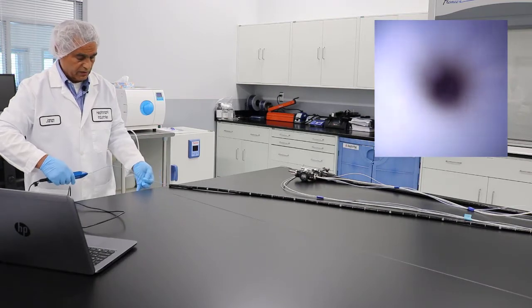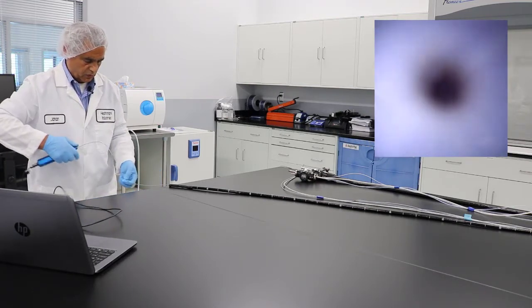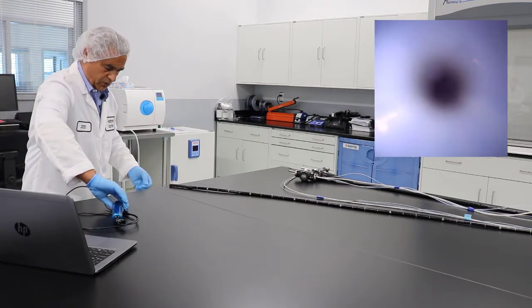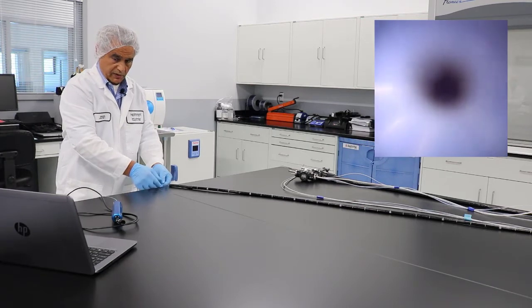If you have debris, you can mark the area to note where you had an issue. When you want to remove it, you can place the scope down if you need two hands and remove it slowly.